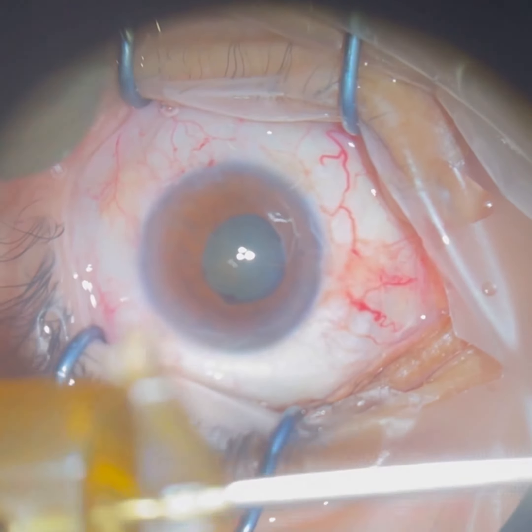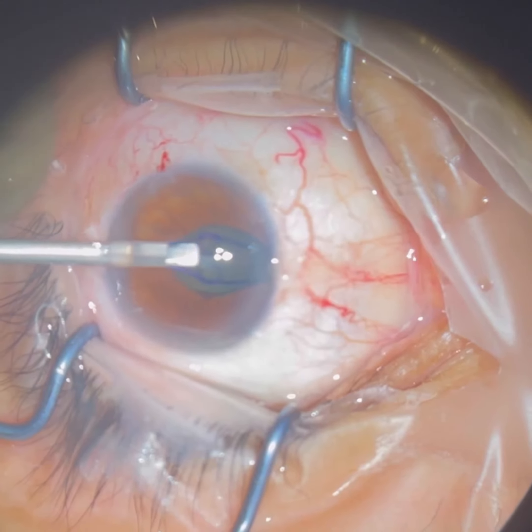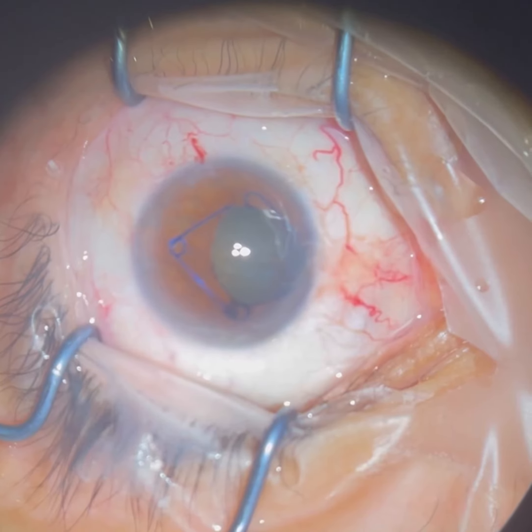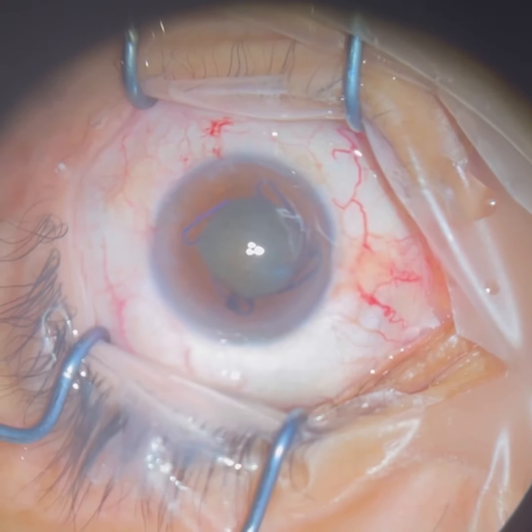What we just saw is us breaking up that scar tissue, and now we're inserting a dilating device called a Malugan ring. This is a device that opens the iris up for us so that we can safely do the cataract surgery.